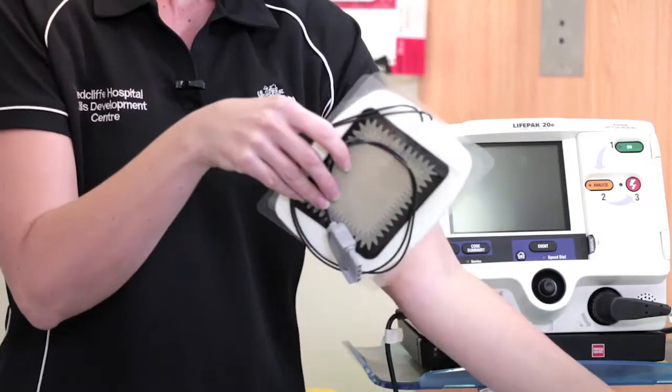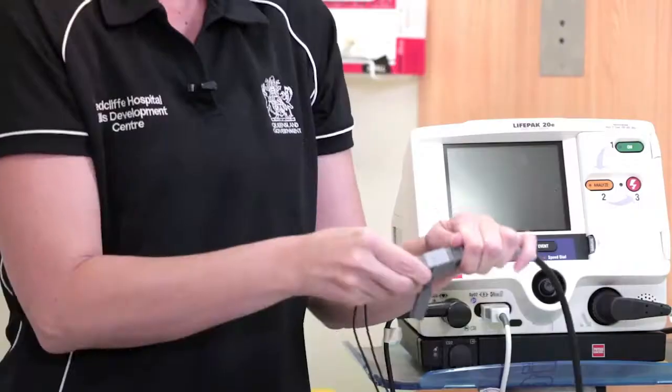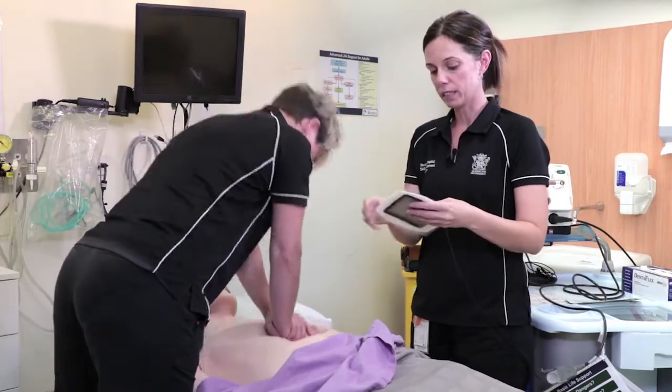Once the LifePak is available, the quick combo pads need to be connected — grey to grey, arrow to arrow — and placed on the patient's chest as soon as possible. The pads need to be positioned correctly around the CPR provider.